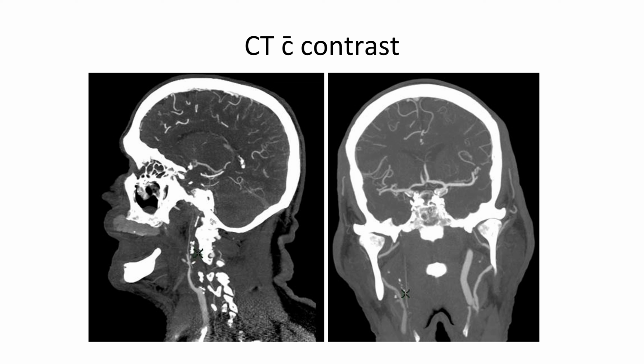Now the vessels in the brain are lighting up because we have this awesome thing called the Circle of Willis. Thomas Willis was the anatomist at Oxford and discovered this sort of vascular flow pattern that enabled the brain to survive even when we have an internal carotid stenosis like this. You can also see it in the image on the left. You can see the thin, almost like a tree branch that's thinning out as it goes up.